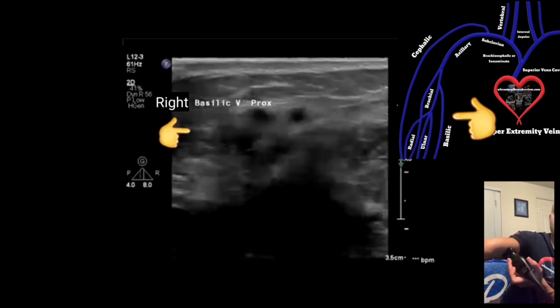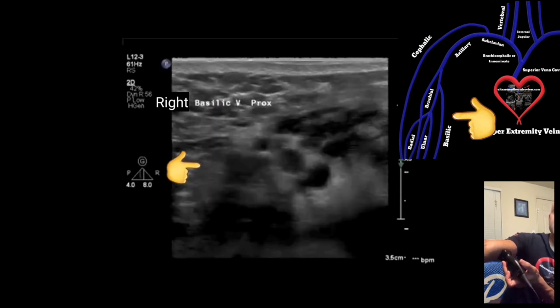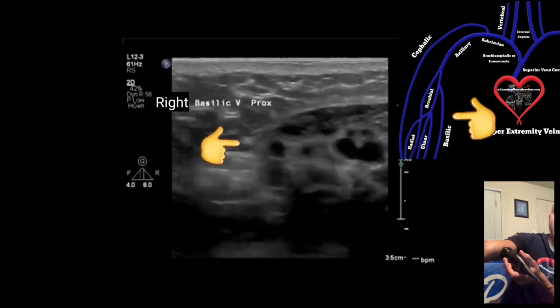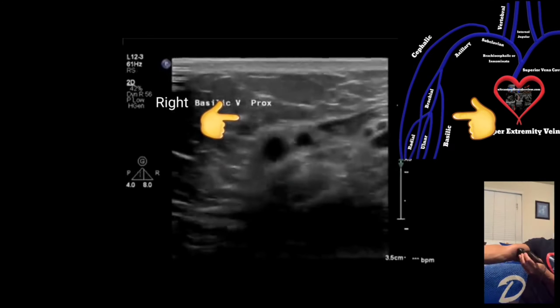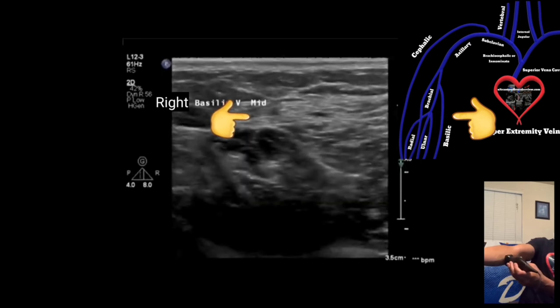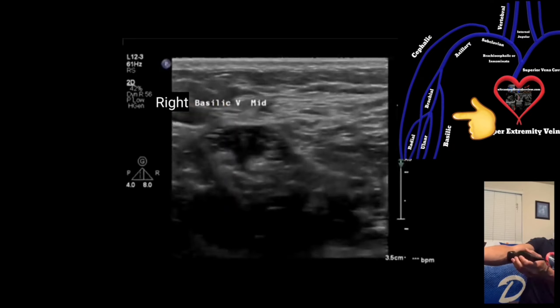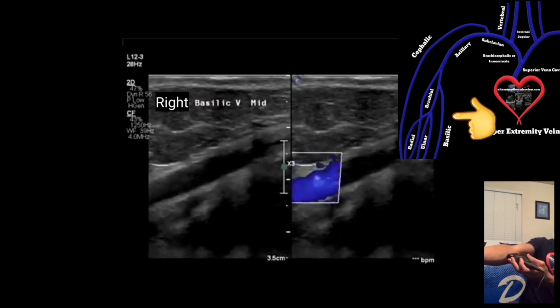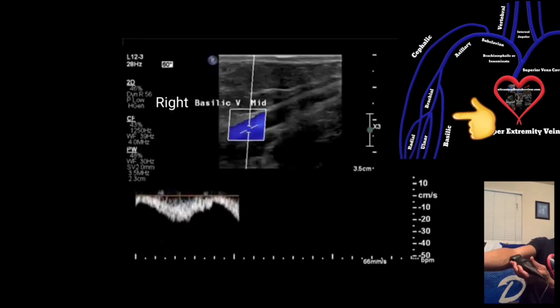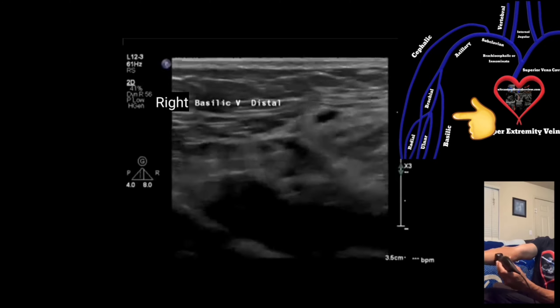Then go to the distal area in the transverse view and compress the brachial veins. The basilic vein typically branches off the brachial vein around the mid-biceps area, so start high and slowly move distally until you see a vein branching off — this will be the proximal basilic vein. Begin by compressing the vein in the transverse view, then move more distally to the mid-basilic area and compress again. Turn your transducer to the sagittal view, turn on color, augment and take an image, then turn on pulse wave and acquire an image while augmenting the patient's forearm.